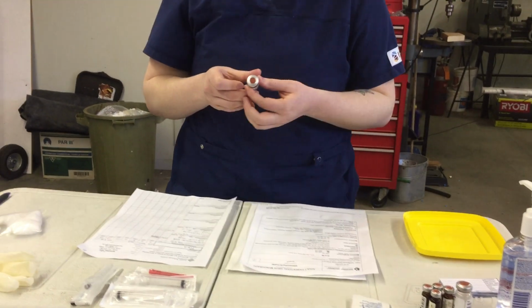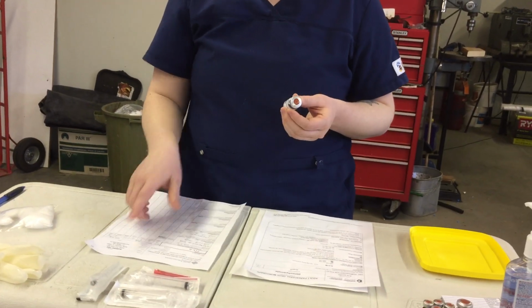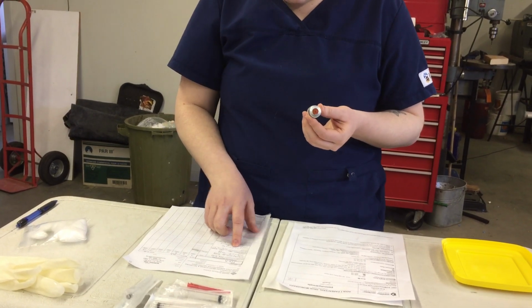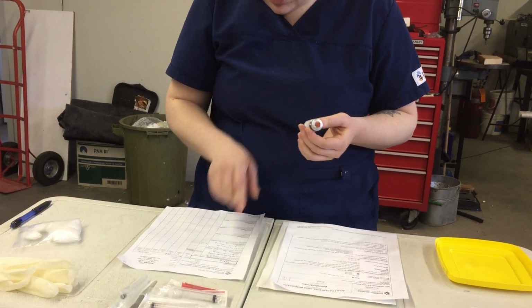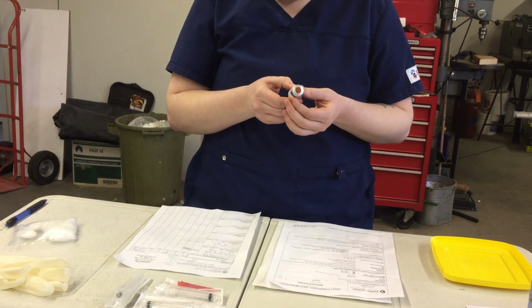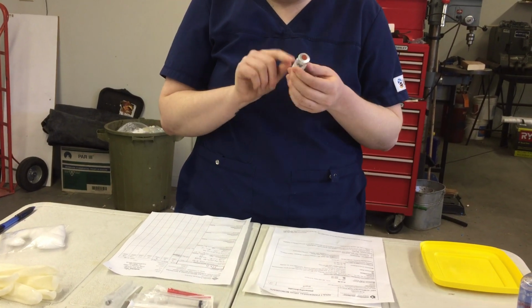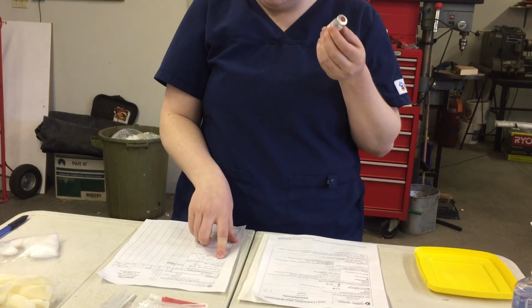and I'm going to get my right drug here. I'm going to be comparing my drug with my MAR. So we have Jake Nursing, January 1st, 1960. He has no known allergies. So we have dimenhydrinate, right drug, 150 milligrams. This is 50 milligrams per mL, so we'll get 3 mLs of this, which will give us the right dose of 150 milligrams.